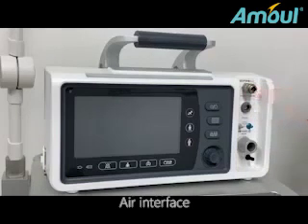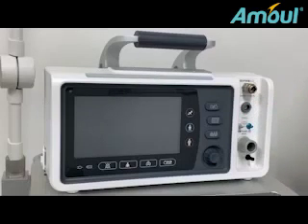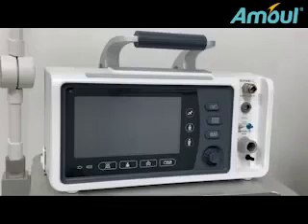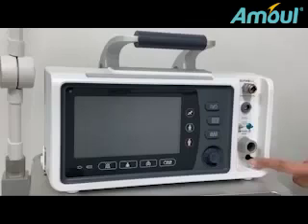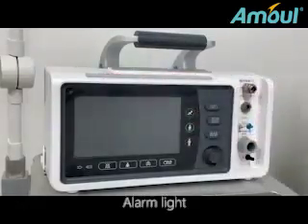Air interface. ETCO2 sampling interface. Flow sensor interface. Fresh gas outlet. PEEP gas interface. Alarm light.